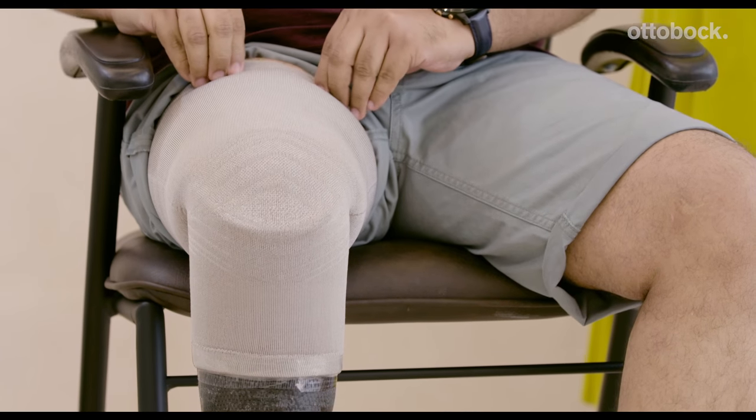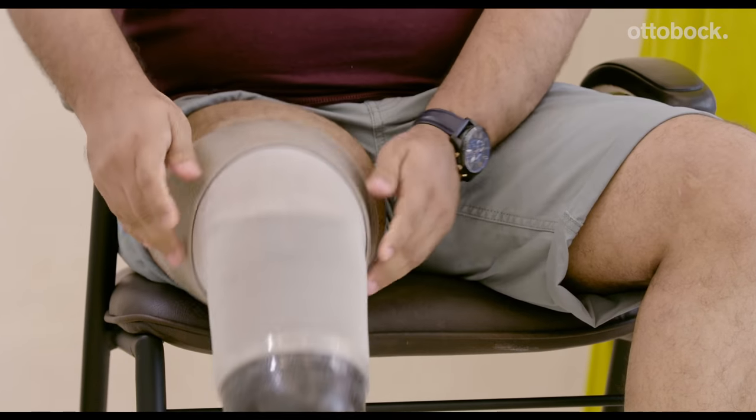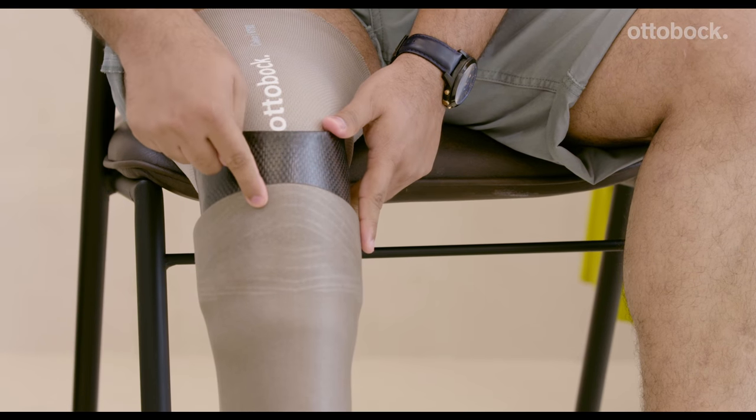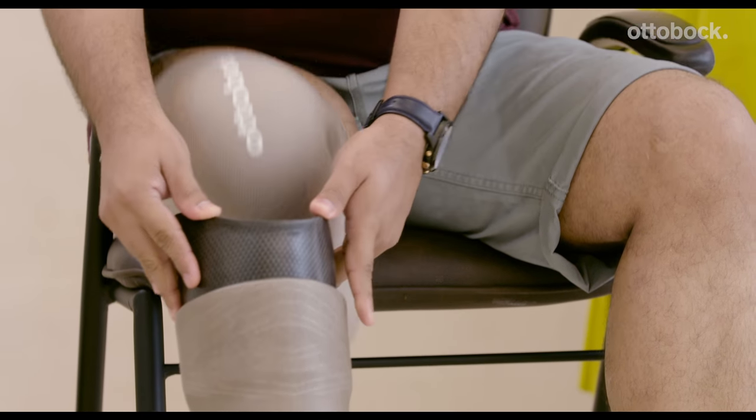To take off your below-knee prosthesis, simply roll over the upper edge of your knee sleeve and continue to slide it down gently while being in the sitting position. Make sure you leave your sleeve attached to your socket in the same position so you don't have to adjust its position every time you wear your prosthesis. Now gently slide out your residual limb out of your socket.